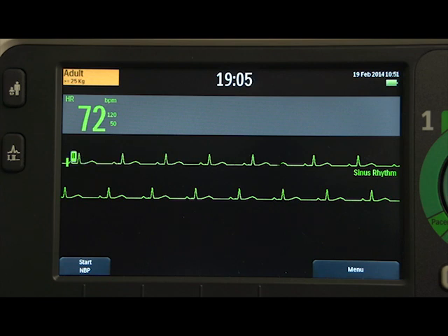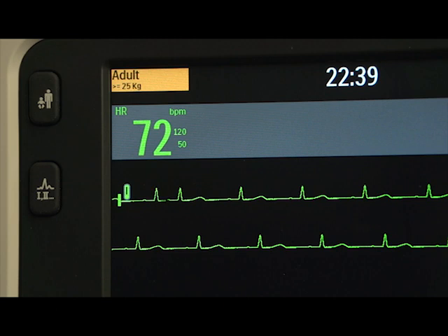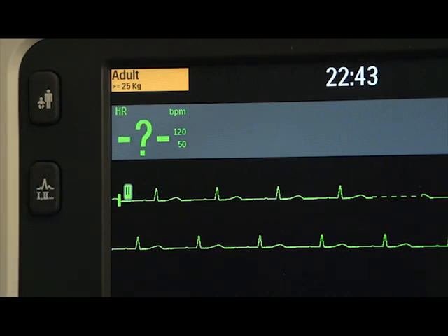You can also change the waveform for each sector during a patient event. How to change a waveform differs depending if you are in AED mode or not. In non-AED mode, the ECG wave for Wave Sector 1 is selected through the Lead Select button or through the displayed Waves menu.